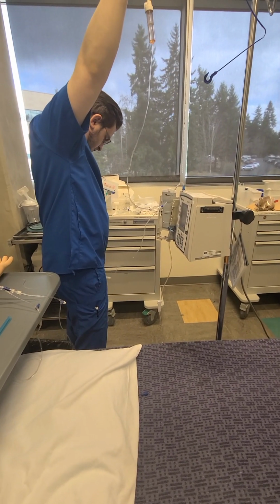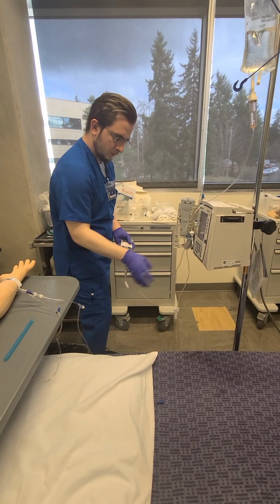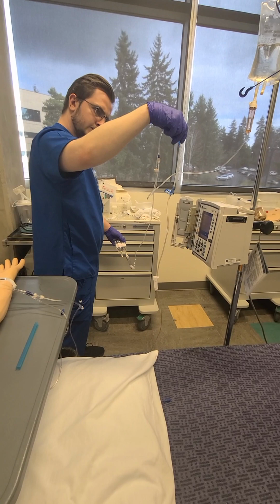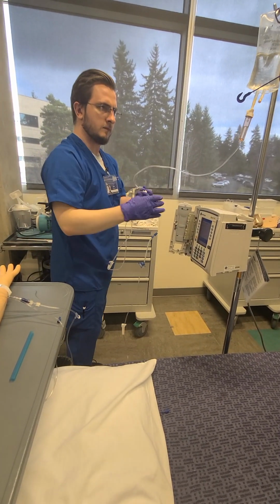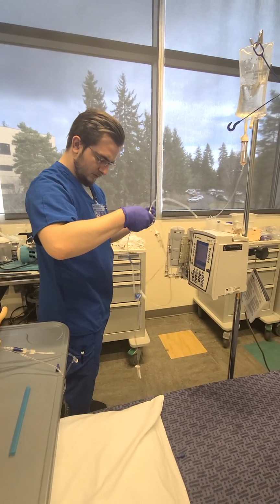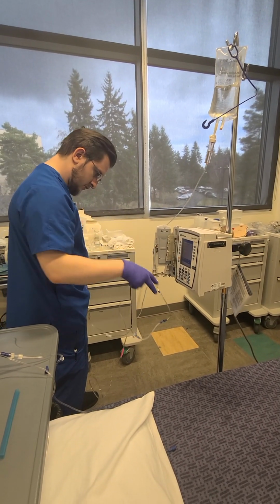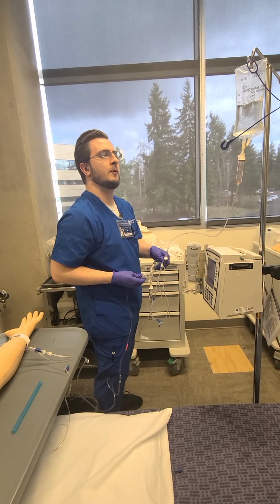He does not want to do it. Line's down. Why is it not going? It does not want to do that. Okay. It's fine. I'll just prime it normally.